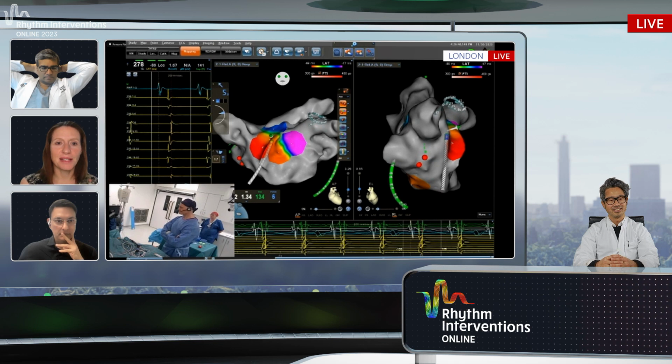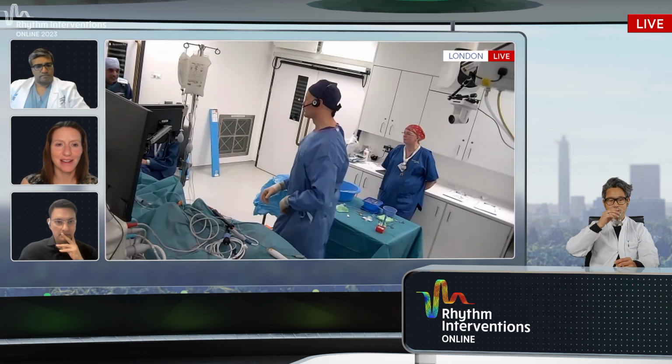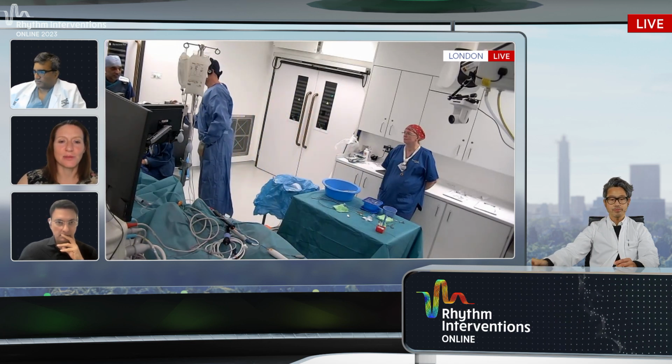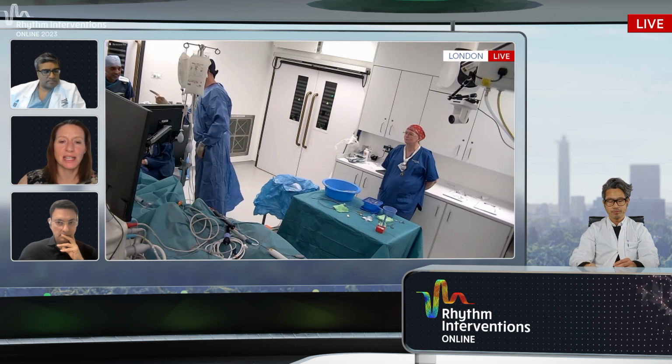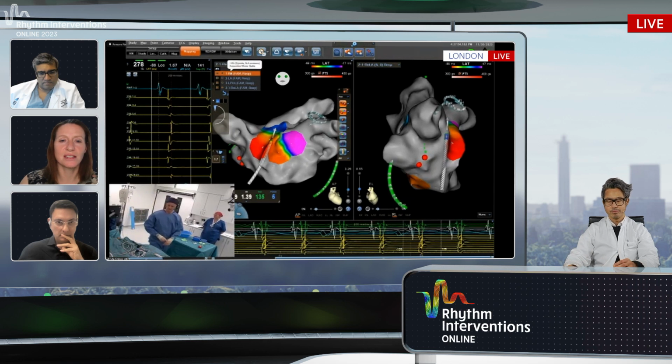Thanks. Yeah, I think it's true that a macro-reentrant tachycardia is going to be the most likely outcome of this. But as Richard has already said, there's always a possibility of a micro-reentrant circuit, particularly around the veins where the previous ablation has occurred.